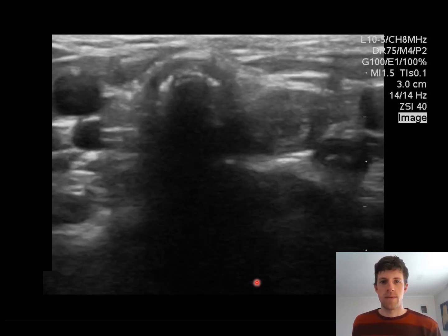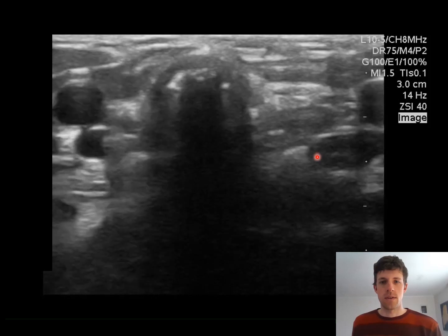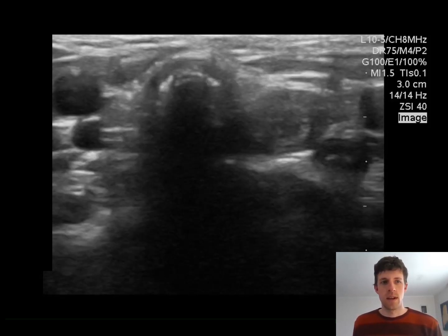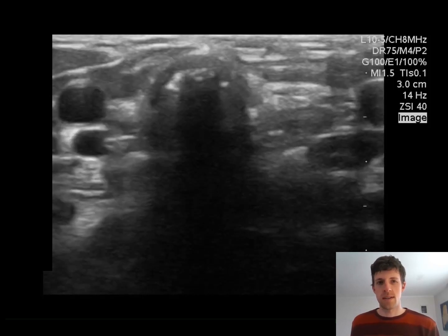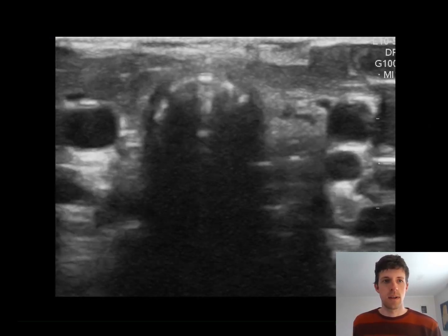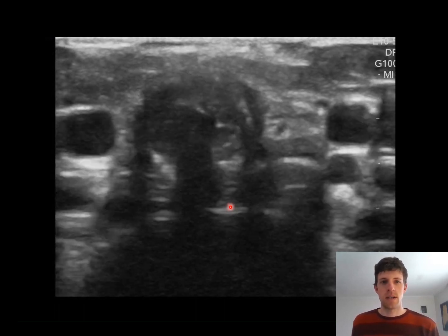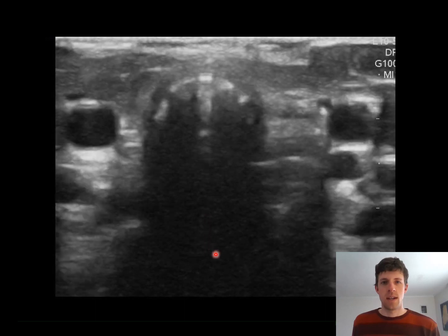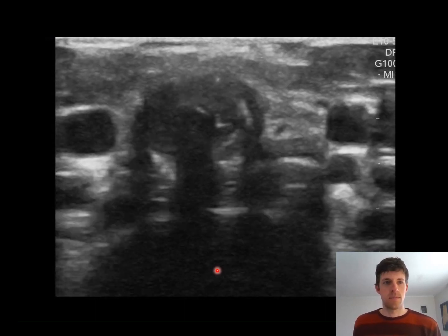To the right of the trachea, you can see air and a circular structure come in and out of view right here. This is an endotracheal tube within the esophagus, which is normally collapsed. Conversely, here you can see the endotracheal tube within the trachea itself, indicating a successful placement of the endotracheal tube.